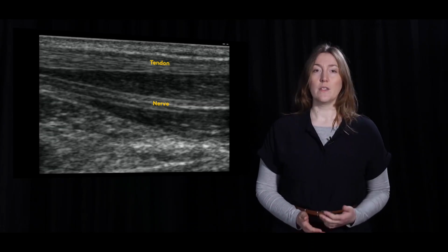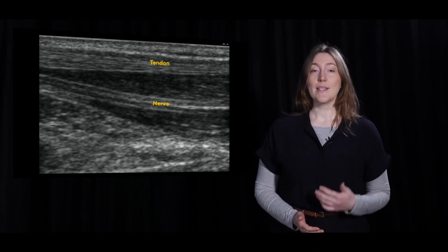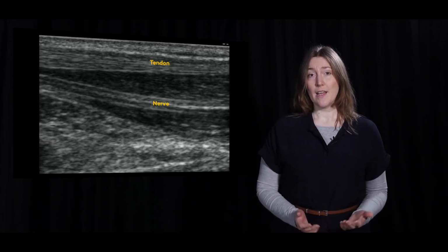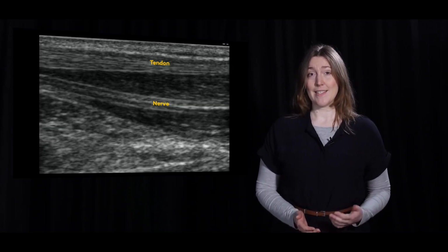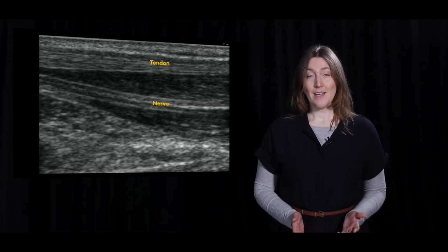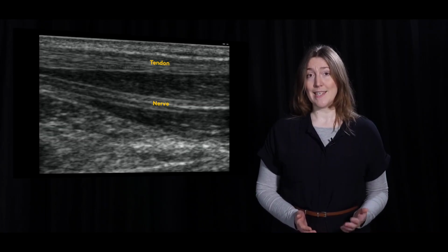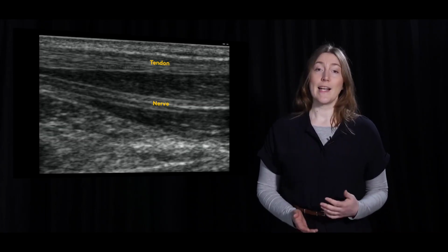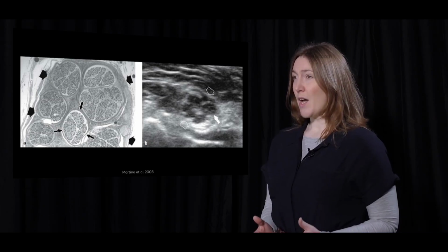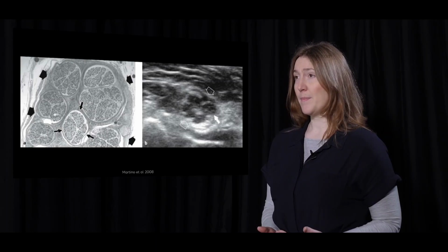The longitudinal nerve and tendon look a bit alike. In this slide, you can see an ultrasound scan of the forearm. To be precise, an ultrasound scan of a flexor tendon and a median nerve. Please note the difference. A longitudinal nerve has less hyperechoic parallel fibres than a tendon and is therefore slightly more hypoechoic. It's made of round hypoechoic areas in a homogeneous hyperechoic background.